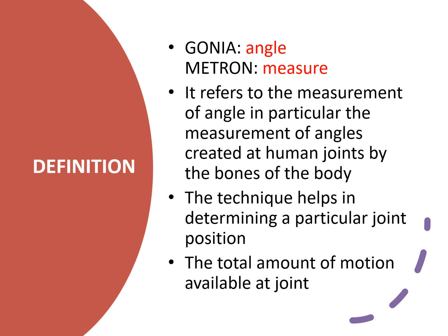So goniometry is a type of assessment technique. It's a diagnostic procedure. Before you think about any exercise or any modality, which you'll be reading much later, that you want to give to a patient, you should first find out the reason behind the issue, the reason behind the movement dysfunction the patient is having.